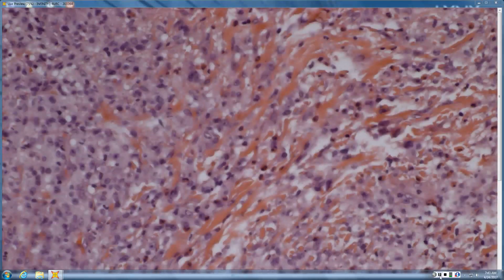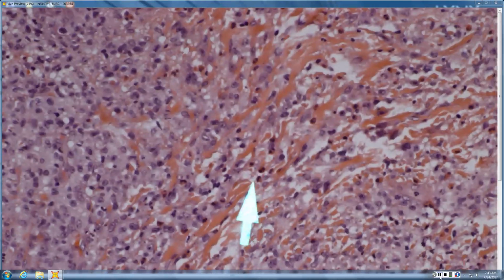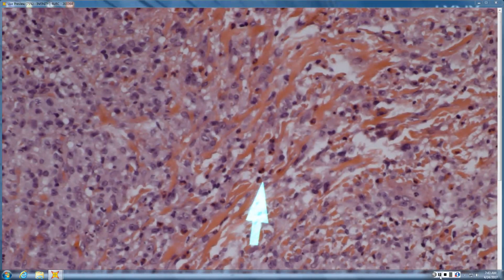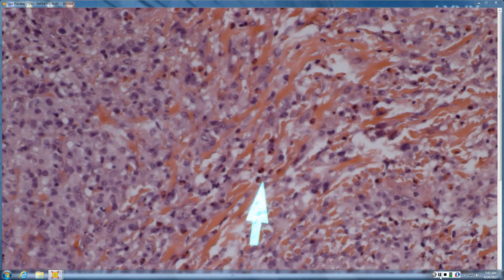So does MF commonly get EOs? If it's follicular. So folliculotropic MF and tumor stage MF. Other than that, usually no. So patch MF, absolutely no. Plaque MF, sometimes. Tumor, real common. Folliculotropic, real common. So when EOs are present, that goes pretty strongly against B-cell lymphoma, T-cell lymphoma, only if folliculotropic or tumor stage, pretty much.